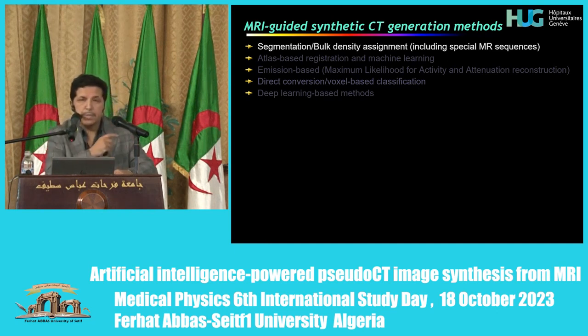We see some different industrial solutions, mostly from GE. And you see that for the same patients, this is the X-ray CT, and the attenuation maps generated from the zero-time echo, the ultra-short echo, and also the Dixon sequence. So very nice work, which is now being integrated into the clinical setting, right?